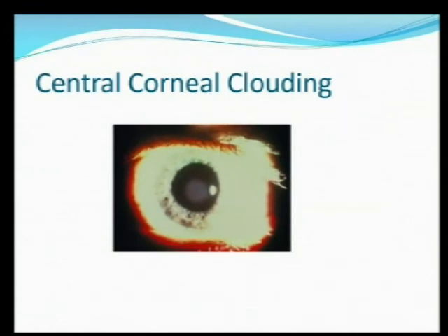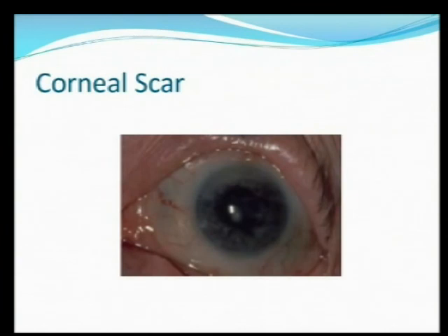Okay. Here's an example, sclerotic scatter with central corneal clouding. Here's some scars.